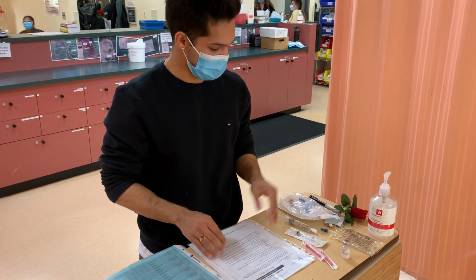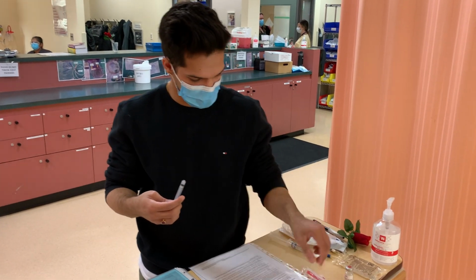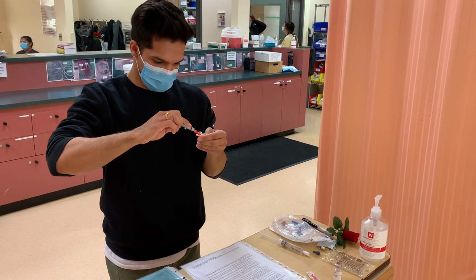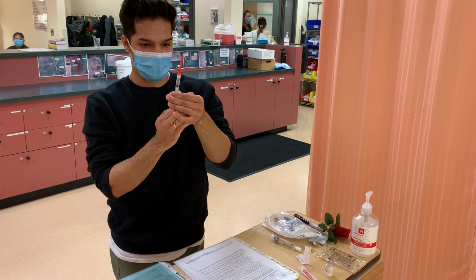Okay, so now that I've done my first actual check, I'm just going to start getting my medication ready. So first thing I'll be doing is just taking out my syringe, just to the side. Okay, I'll be drawing this back to about 1 ml, which is what I'm going to be injecting into my vial.